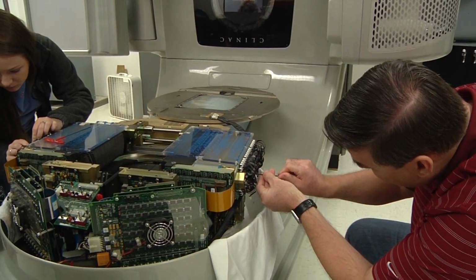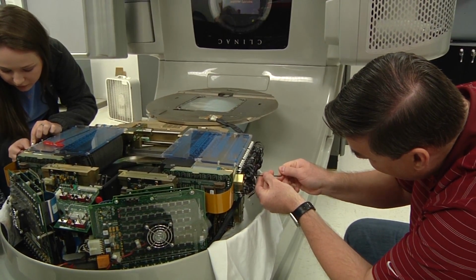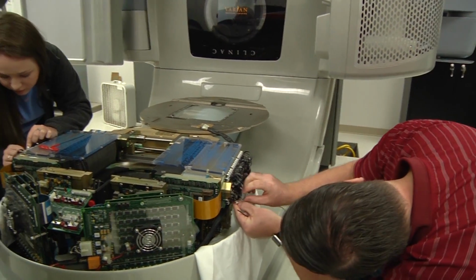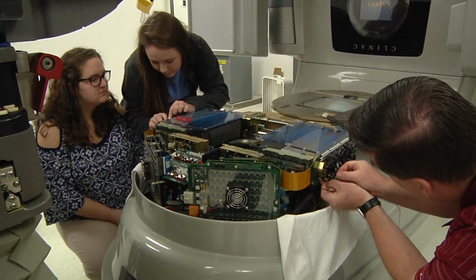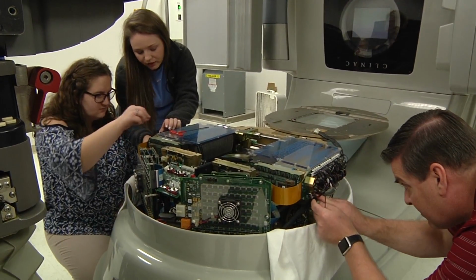On the part where it shows the MLCs, can you load up a field and then press initialize on there as well? Does that do the same procedure? You can. So in treat, you'll have initialize and it'll have park.